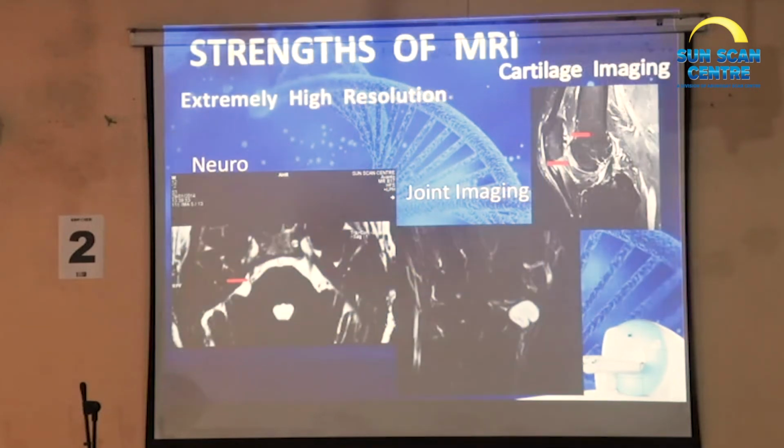Now this is an example of resolution. Can everybody see this first image where there is a title of neuro written there?